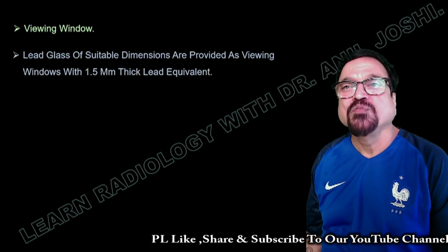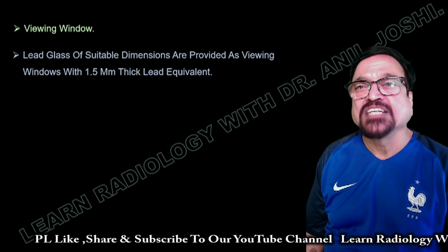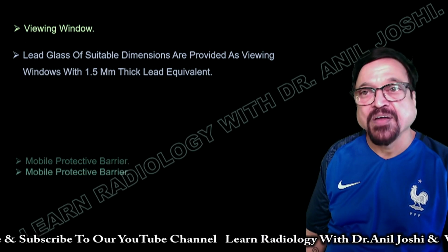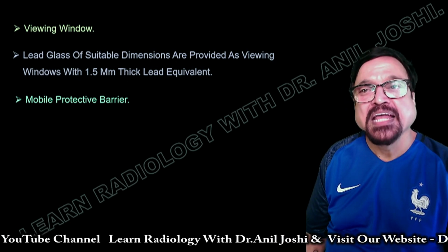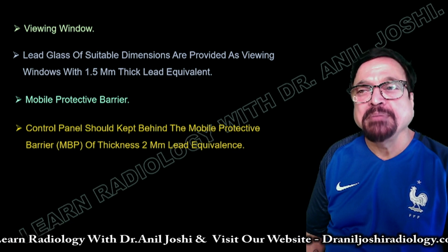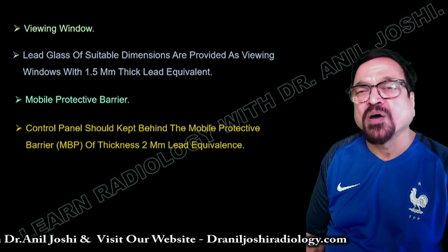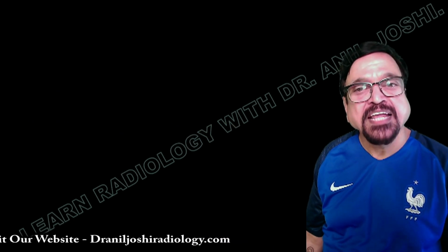Easy to remember. Now viewing window, lead glass of suitable dimension is provided as viewing window with 1.5 mm thick lead equivalent. So it also should be protective. Then there should be a mobile protective barrier whenever required. The control panel should be behind the mobile protective barrier which has a thickness of 2 mm or equivalent. Here the best, what we say, is to have a separate room for the control.